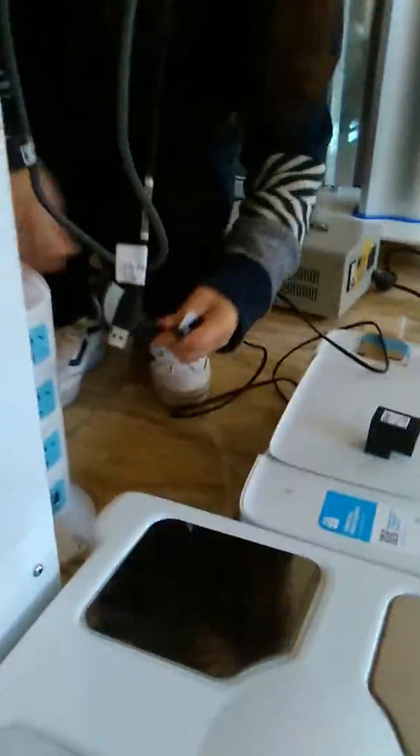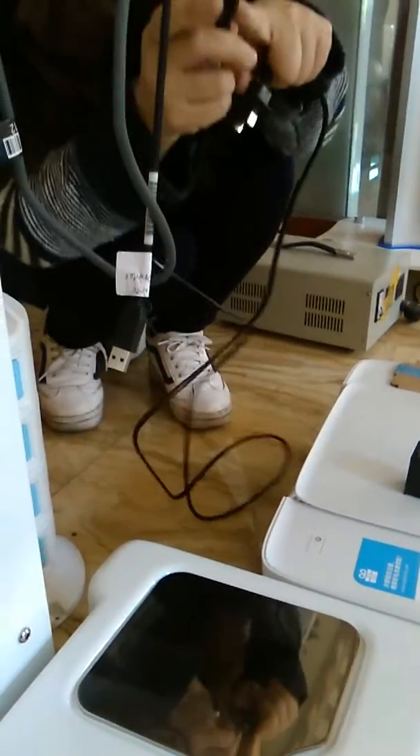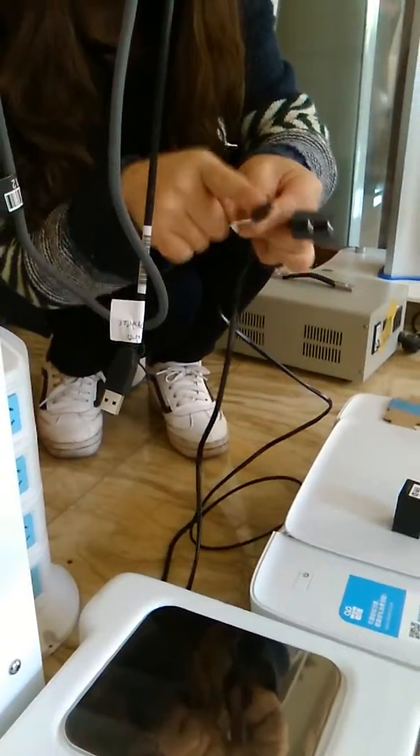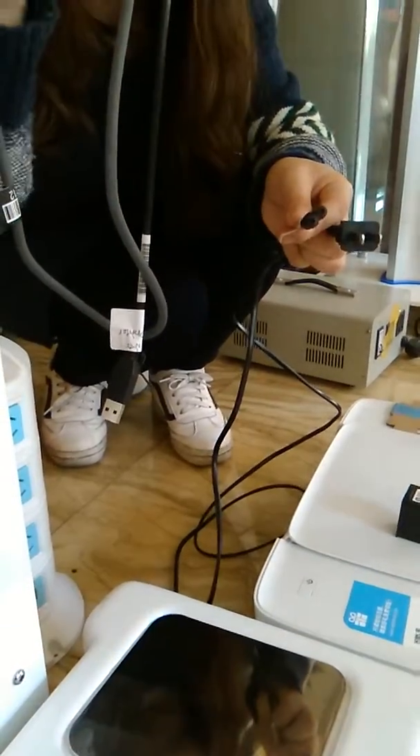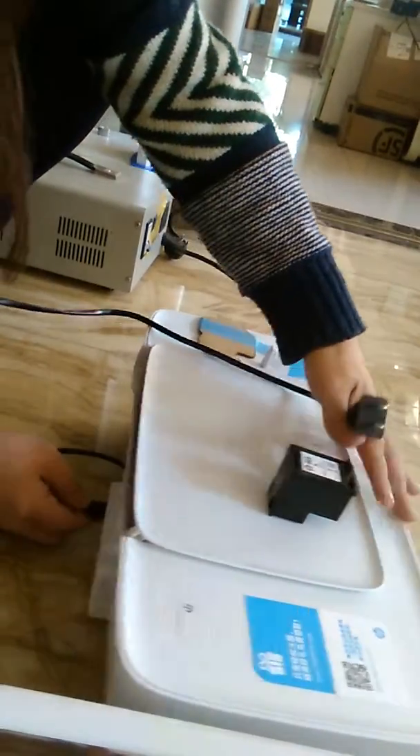This is the printer power line. Because it looks like the same, please do not enter this line to here. Remember, only the handle line can enter here.